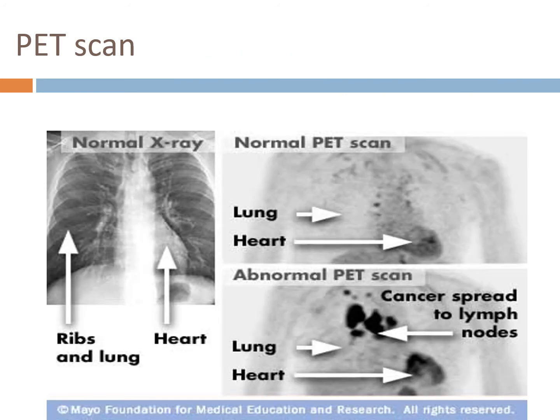Now, PET scan is another. I haven't been to a PET scan for a long time. This is generally used to diagnose cancer. You see these little spots that show up, and basically the patient fasts for several hours. Then they're injected with a radiopharmaceutical labeled sugar water.